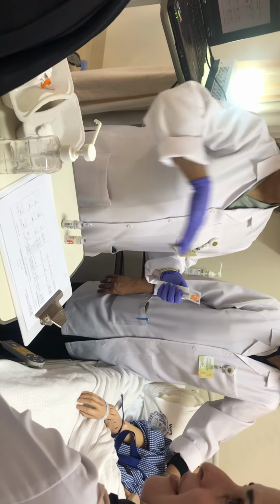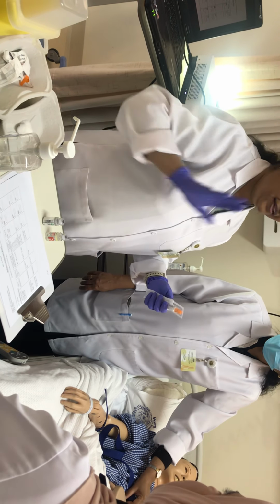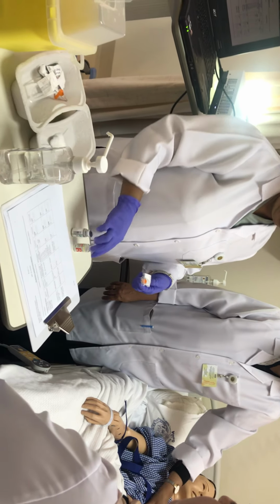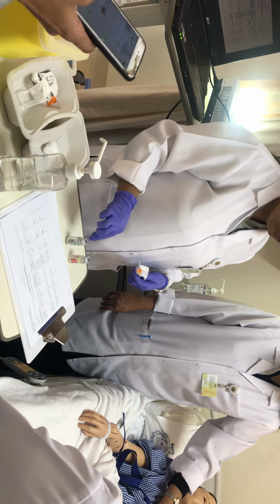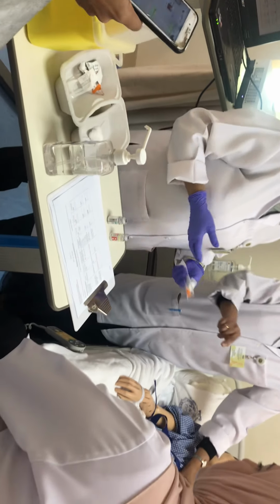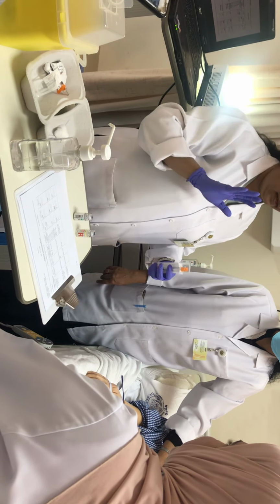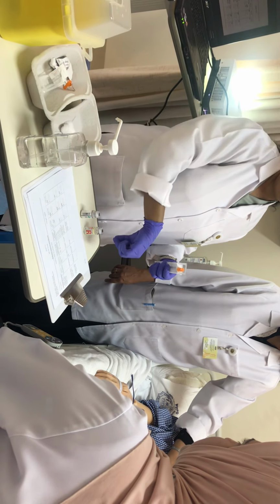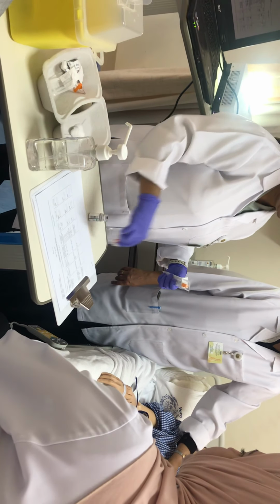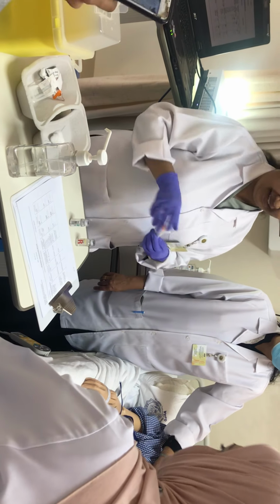Okay, and students have a lot of questions when we do this procedure. They ask us, air first, why not? What is it? Even I'm not fully sure, because see, you're saying that you're taking clear first, then going here, because you do not want any of these particles to come over here. But you are mixing and giving it to the patient, nothing is happening. So I'm not telling all that to the student, but the company says this cloudy insulin should never mix with the clear one, because it can change the potency of this medication. That is the reason they do it like that.